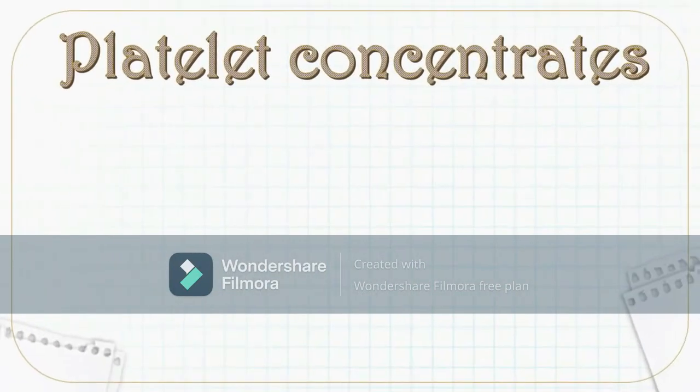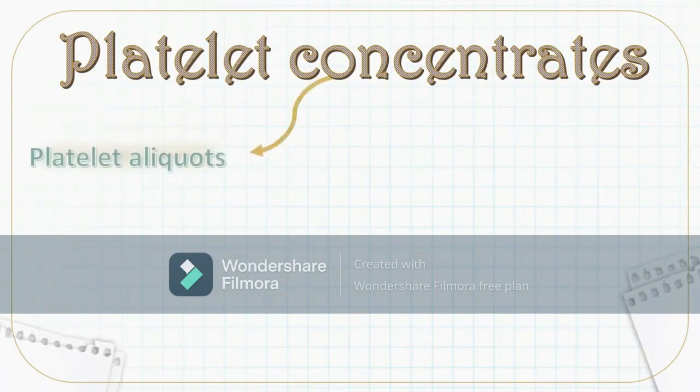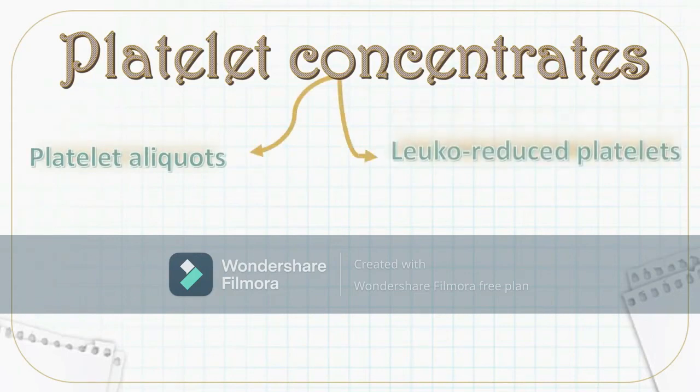Now, just like our packed red blood cell units, your platelet concentrate could also have certain specifications depending again on who will receive the unit and at the same time for the purpose of avoiding adverse transfusion reactions. Platelet concentrates can be further prepared as platelet aliquots or leuko-reduced platelets.